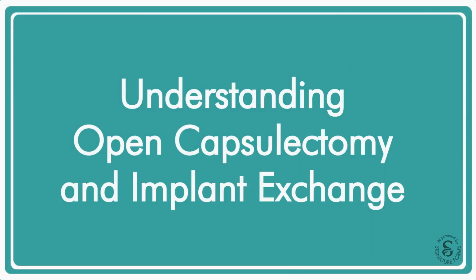Let me start by explaining what this surgery is meant to address. Open capsulectomy and implant exchange is a revision procedure used when scar tissue has formed around a breast implant or when the implant pocket needs to be reshaped. That internal scar tissue can tighten over time and make the breast feel firm, look rounder than expected, or even become uncomfortable.